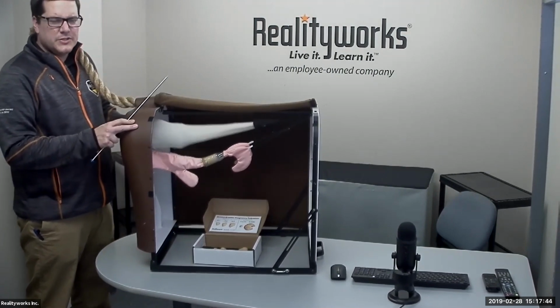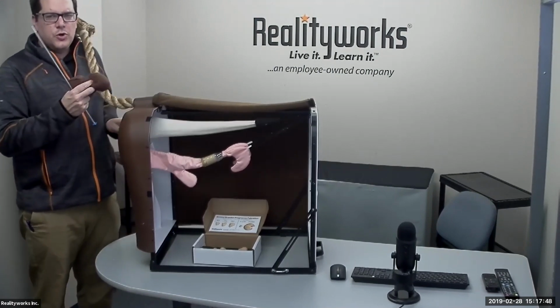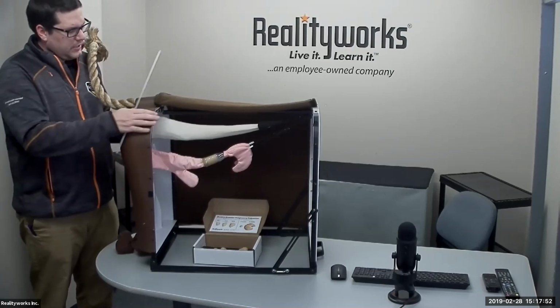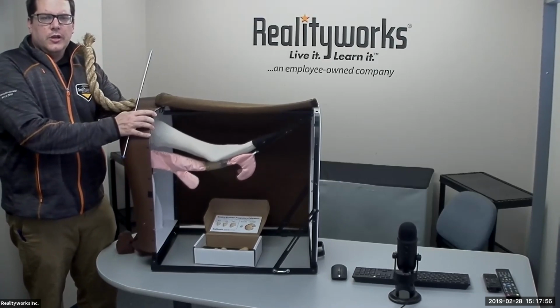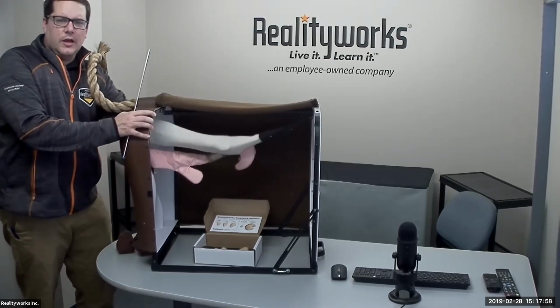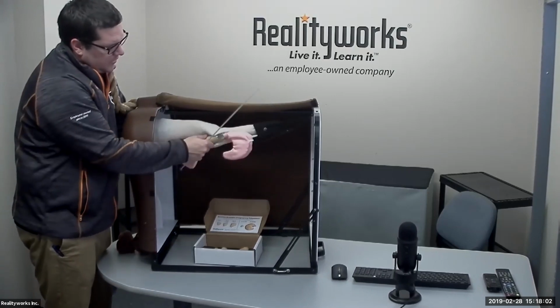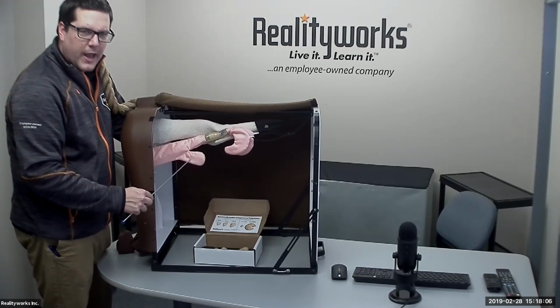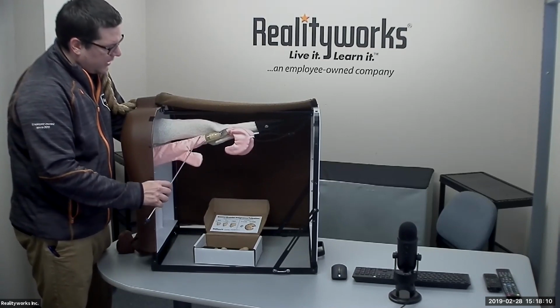And what I'm going to do is we have what we call our feces or our fake poop bags here. And we're going to take those out, because you want to have a nice clean area when I'm getting my hand in here to be able to come down and look for the cervix. Now, inside here, we have the tract itself. We have the bladder, so you have to be careful that you don't go down in the bladder. That's why in this case you want to stay at 45-degree angles and stay right along the top.